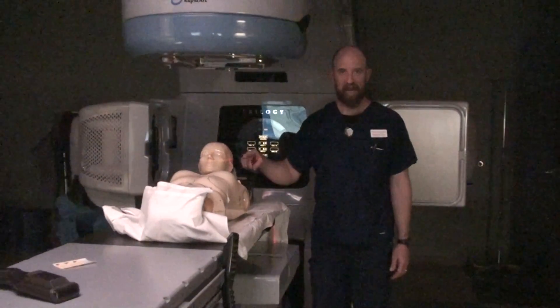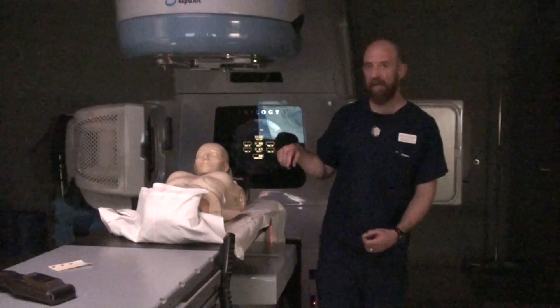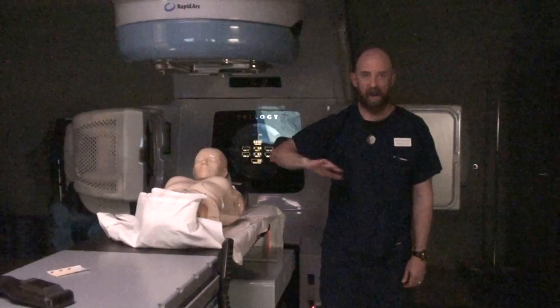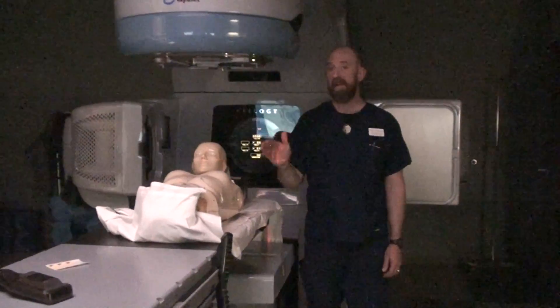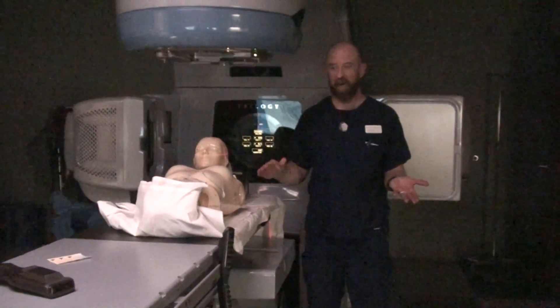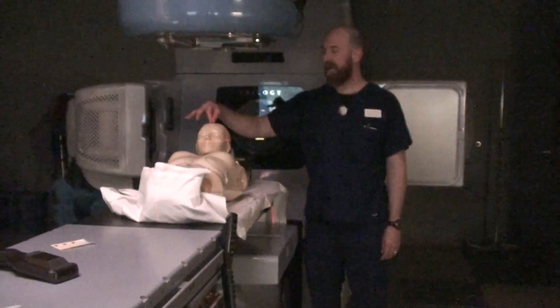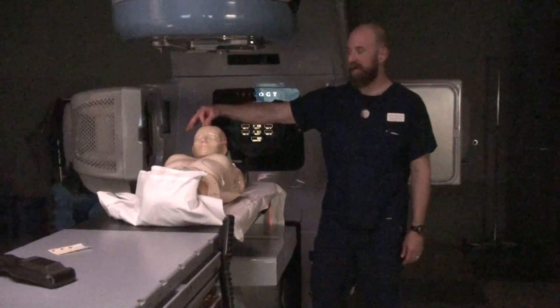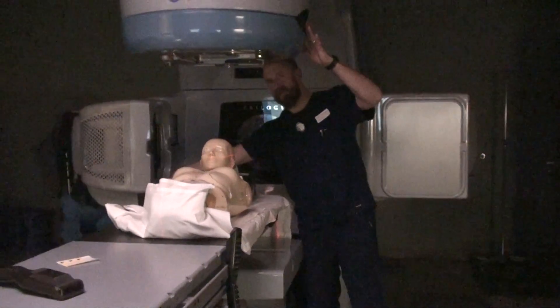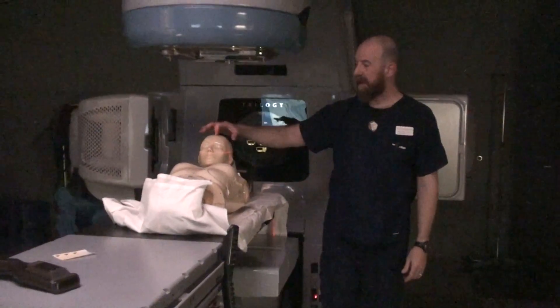Now that the doctor has approved the anterior field radiographically, still demonstrating that the outer canthus is inferior to the inferior aspect of your field size, you now have X, Y, and Z set. Come in, notate everything — gantry, field size, collimator, and all your table settings, including your lateral table setting from your lateral gantry angle. Mark this anterior, and while you're at it, mark the other side while the gantry and image intensifier are out of the way. Now you've got a three-point setup.